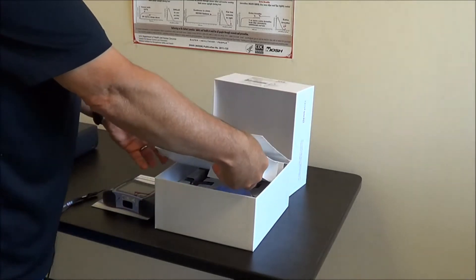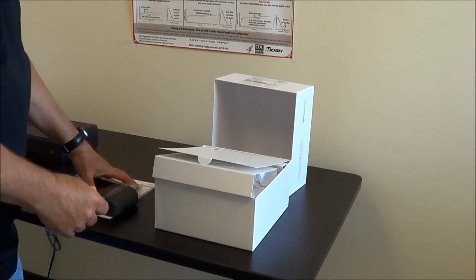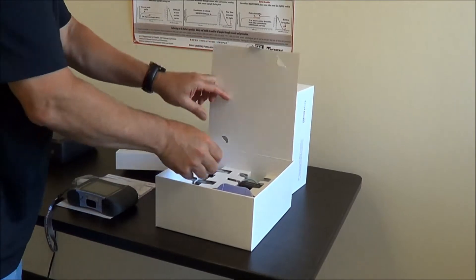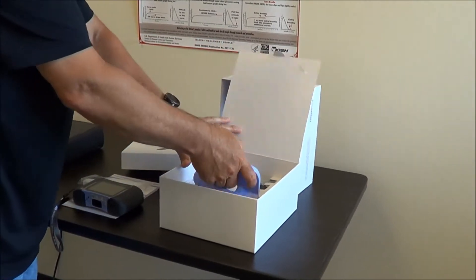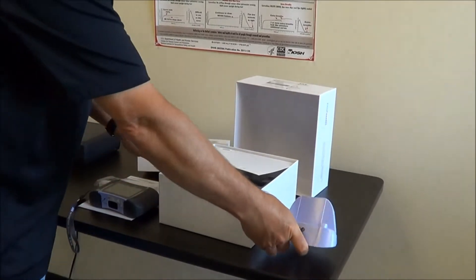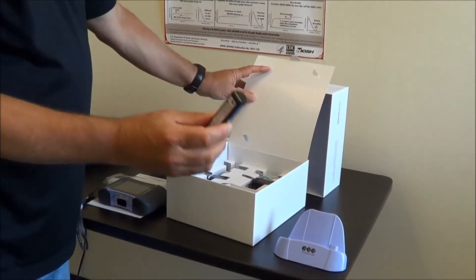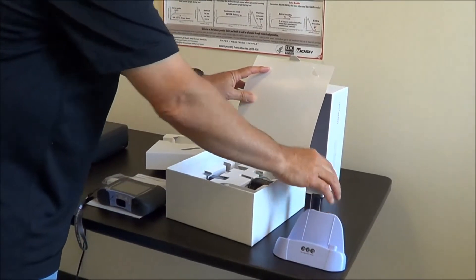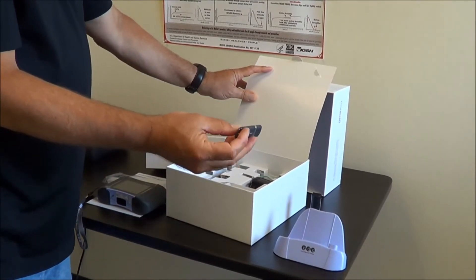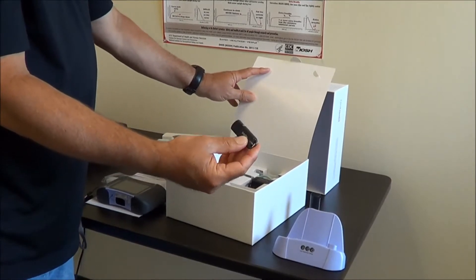Here we have four flow tubes — single patient use disposables. Inside the box we've got a cradle, which is used for connecting to a PC or a printer. A chargeable battery that we'll install in a moment. We have a flash drive here that has the user manuals as well as the EZ-1 Connect PC software if you decide to use the device with a PC.